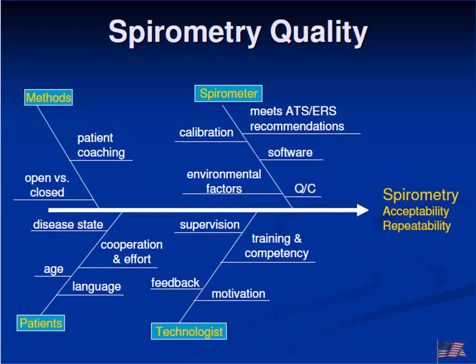So again, are we doing this correctly? How about that open and closed system? If I have a leak in the system, my helium dilution is not going to work really well. And then also the machine that we're using itself has to have done the proper quality control. There's multiple factors that are going to go into whether or not this is done correctly. And unfortunately, again, especially in the physician's office, they're not all paid attention to.